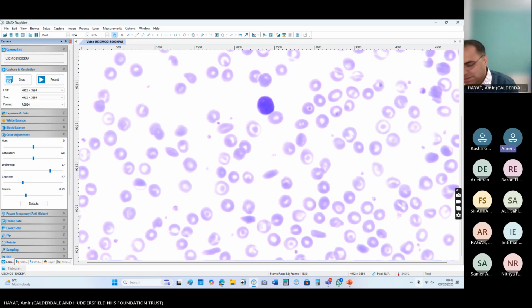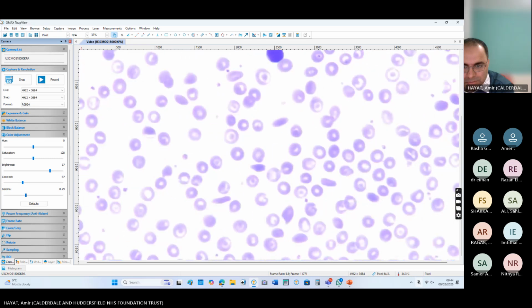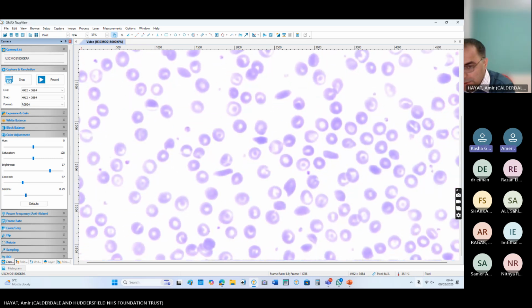Okay, so you want HPLC from me. The sickle hemoglobin is 78%, A2 is 7%, A0 is 5%. Sickle beta. A2 is 7%. Sickle beta.